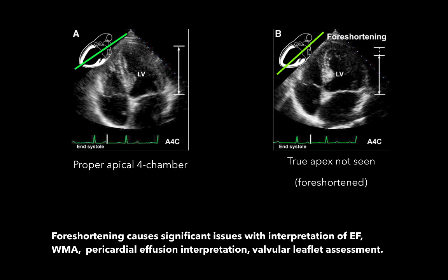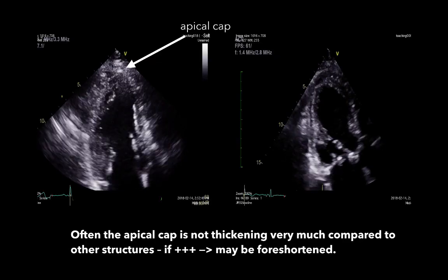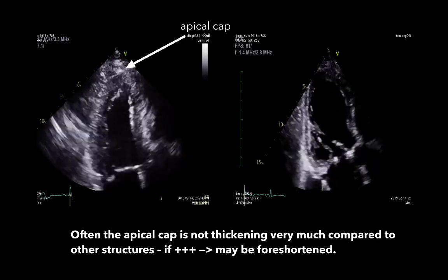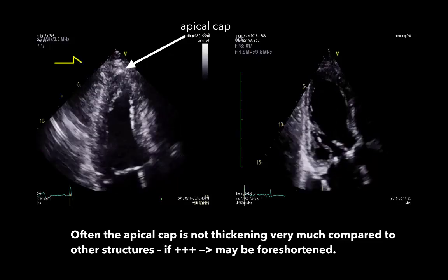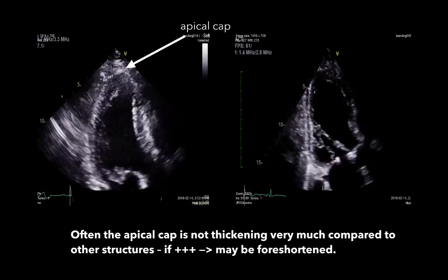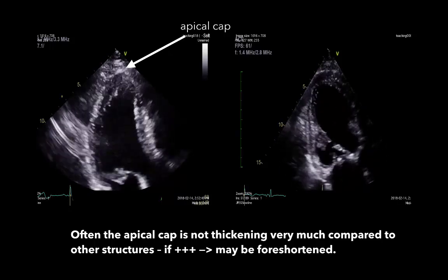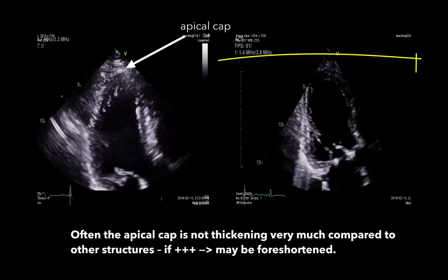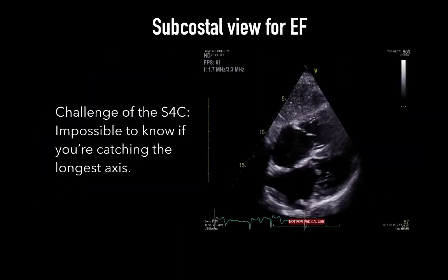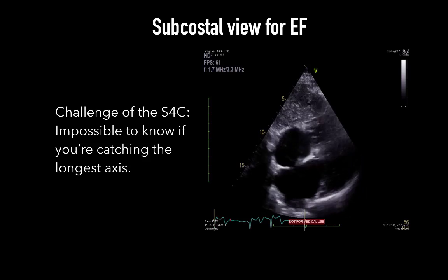Usually, a foreshortened LV appears to have a better EF than it actually has. To avoid foreshortening, one should always attempt to obtain the longest view of the ventricle and ensure the apical cap or apex is not moving, as seen on the left clip. The apex should be the anchor of the heart during echo assessment — it should only thicken, not move in space. Its contraction is usually the smallest of all LV segments. The right clip, in comparison, shows a moving and thickening apex that changes during every contraction — this is not the true apex. Foreshortening is why the subcostal four-chamber view can be challenging for LV assessment.